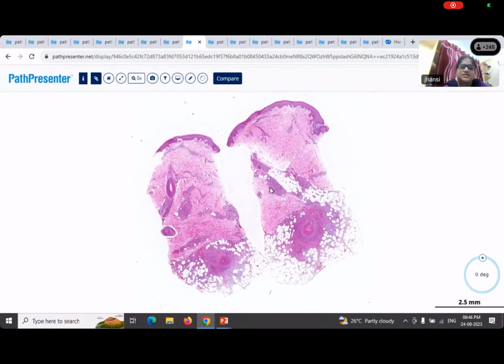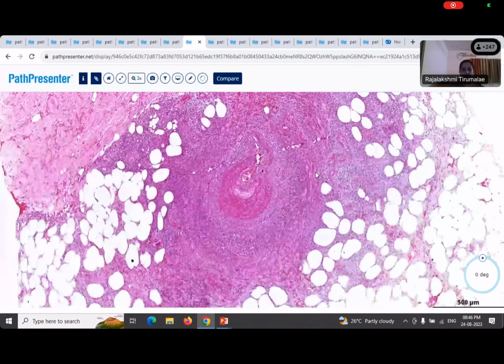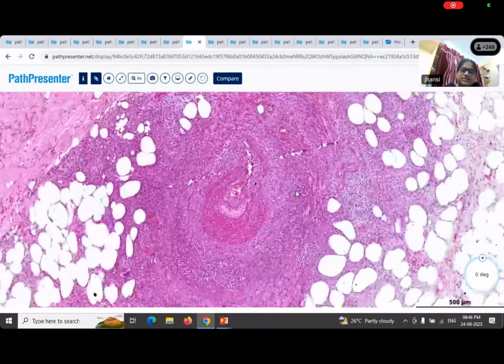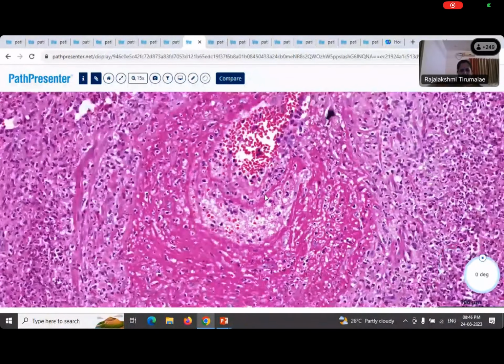In the dermis, there is a nodular type inflammation, ma'am. And in the subcutis also, there is inflammation. Panniculitis is there, ma'am. Okay. Anything else? And the blood vessel is thickened, ma'am. Thickened wall is there. And within the blood vessel also, the endothelial cells are a little prominent. Okay. Can you really make out the endothelial cells? Ma'am, that's fibrin and necrosis.